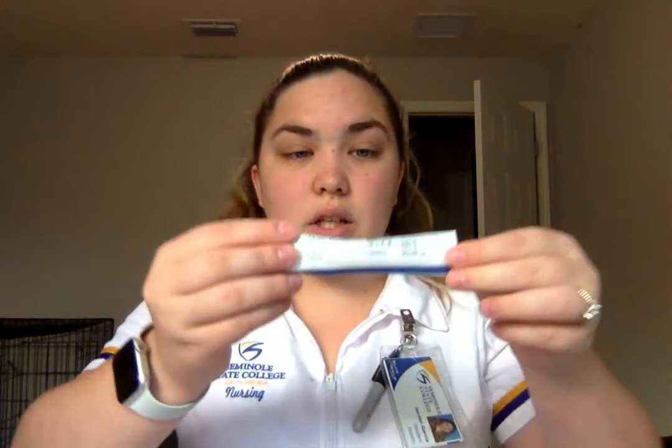Okay, so now that I have all of my supplies gathered, I'm going to go ahead and start drawing up my medications. So I'm going to start with my influenza vaccine. I'm going to draw that one up first. And for my influenza vaccine, I'm going to be using the 23 gauge and 1 inch needle.